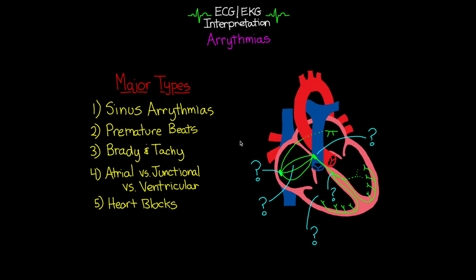Alright, welcome back everybody. This is going to be our third lesson in our series of lessons covering ECG and EKG rhythm interpretation. And in this lesson, we're going to take a dive into arrhythmias.